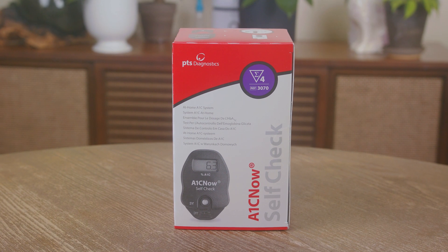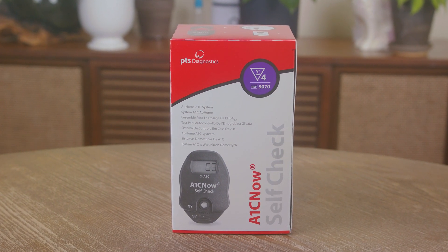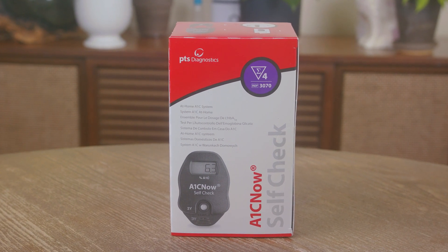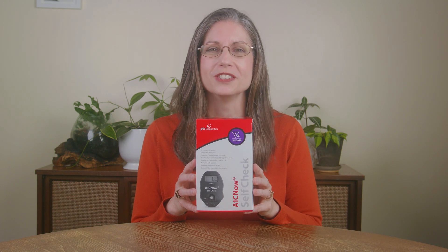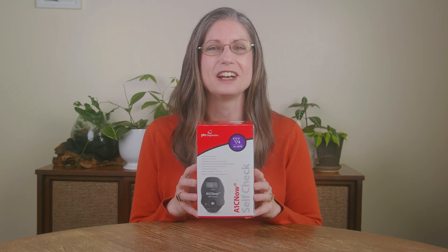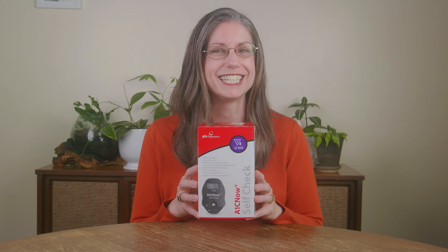As a reminder, the test results will remain displayed for 15 minutes and will turn off automatically. And with that, you have successfully completed an A1C test using your A1C Now self-check system at home. Remember to keep the analyzer and the remaining pouches together in the box until your next test. When storing your test kit, be sure to keep it out of direct sunlight. Please visit ptsdiagnostics.com when it's time for you to run your next A1C test, and I'll be here to walk you through the steps again. Bye for now — stay well and take care.